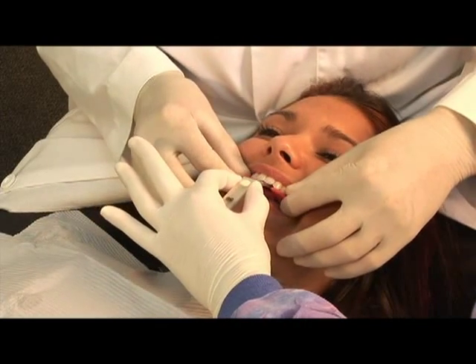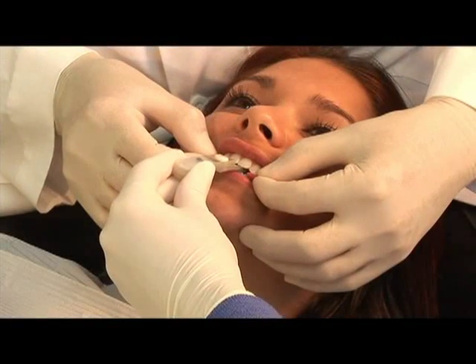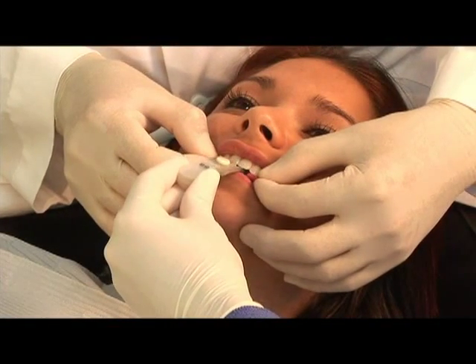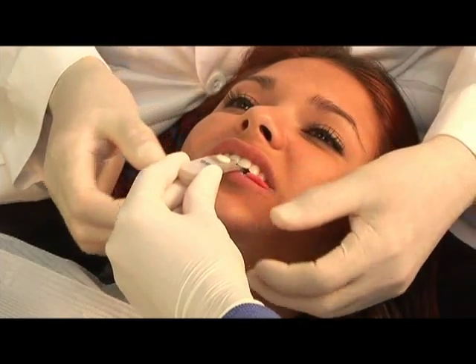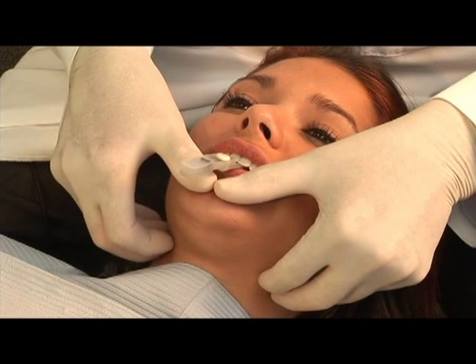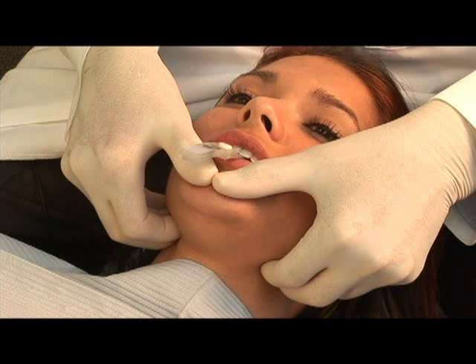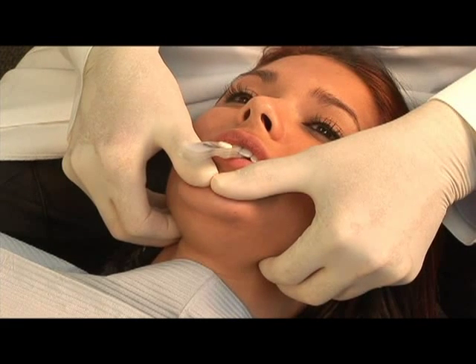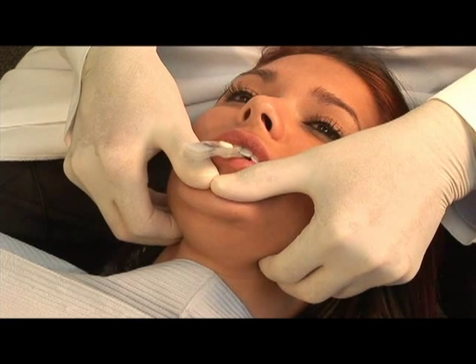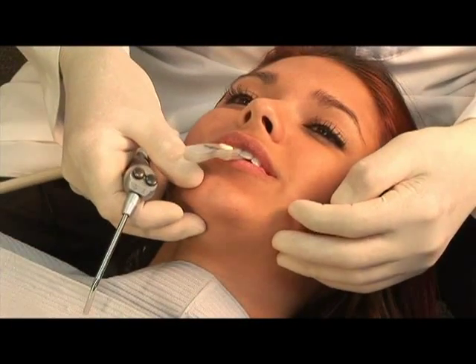And your back teeth, close, squeeze. Slide your jaw forward slightly and back. Hold right there. Okay, we're going to check, make sure your jaw's in the right position again here. Hold right together with that. You feel a little pressure. You shouldn't feel any pain. All right, now we're going to chill the wax here with a little bit of air.